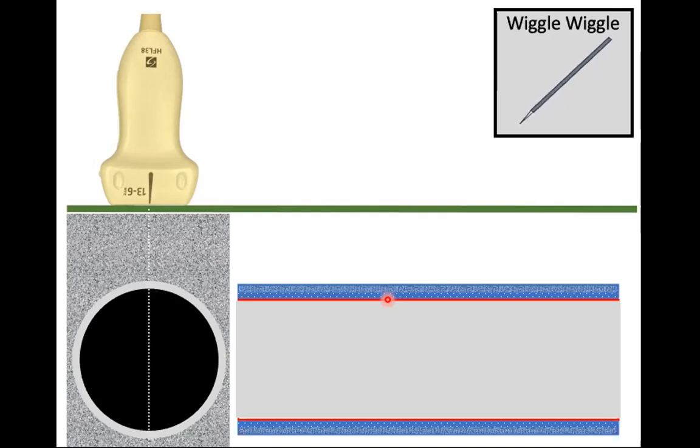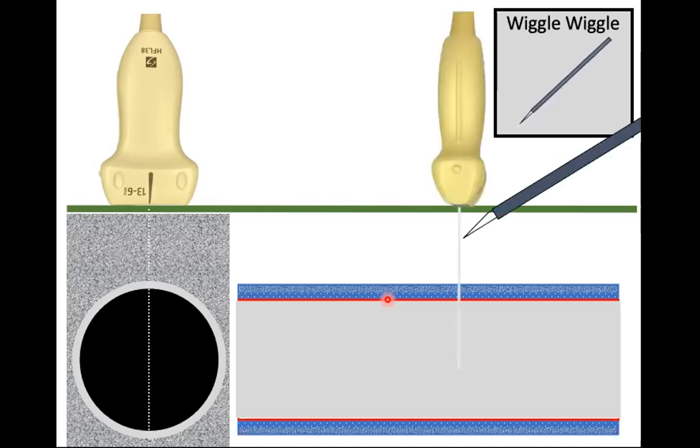All right. One of the challenges when you first start out, you've got your probe there and you've got your needle underneath the skin. You're like, where the heck is my needle tip? All right, you cannot find it for the love of God. You're freaking out. You're moving things around, you know, it's stressful. Slow down. Okay.